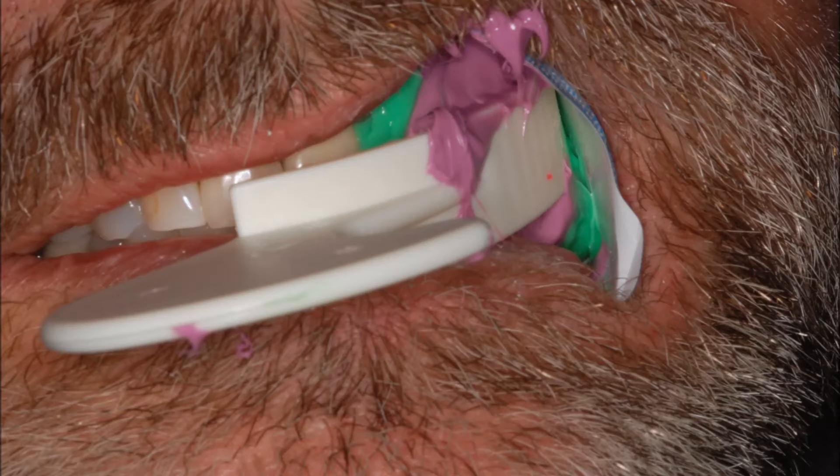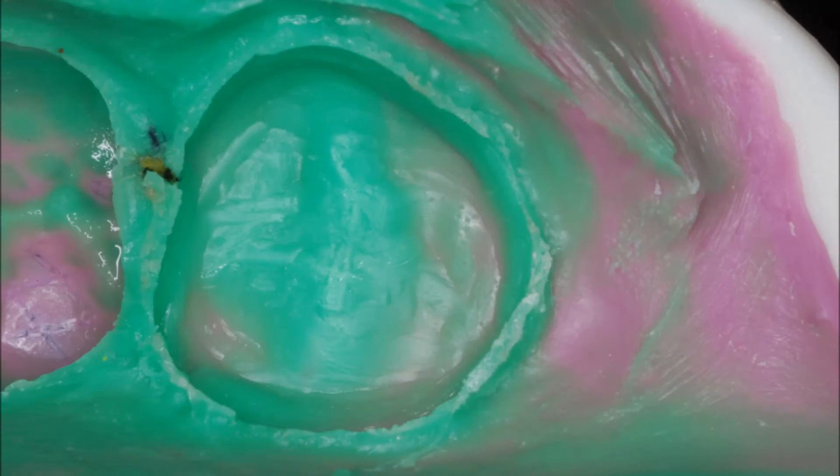Triple tray impression. Patient closes down on the triple tray as the Garmers is removed. Neo-drys are left in the mouth while the impression sets up. Impression number 18.